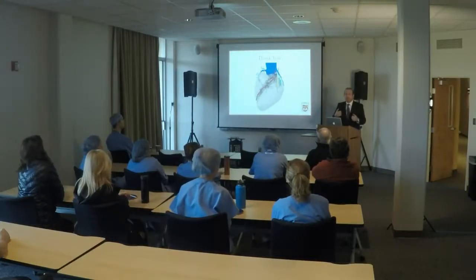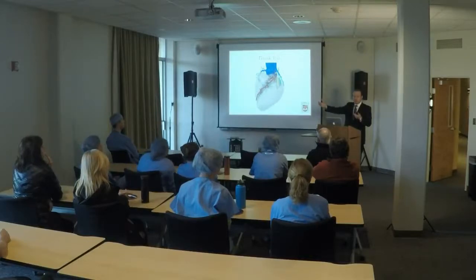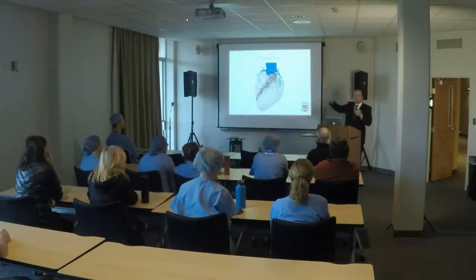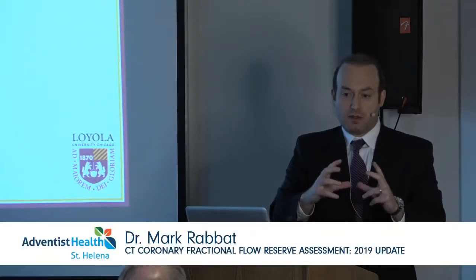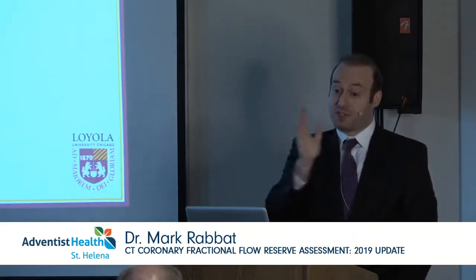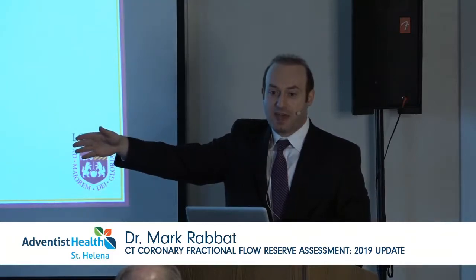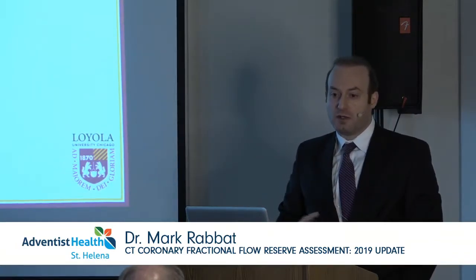At our center, we create one report. So we'll pend the coronary CTA. We'll wait and if we need the FFR CT, if we don't need it, then we'll just sign it. If we need the FFR CT, we'll wait for it to come back. The fellow usually dictates it, and then they'll send it to our queue, pend it. Once we get the FFR CT back, then we'll just add that into the body of the text with one interpretation. But some centers addend it, so they'll sign the CT, and then they'll wait for the FFR CT to come back, and then they'll just addend the CTA report. But I just think it's cleaner, and it's easier to interpret when we do one interpretation for the provider, referring physician.